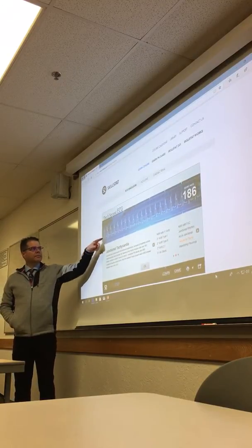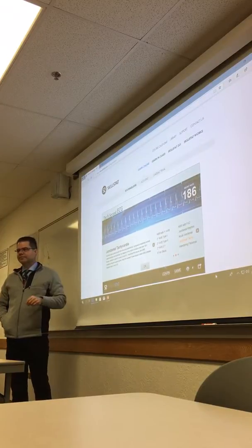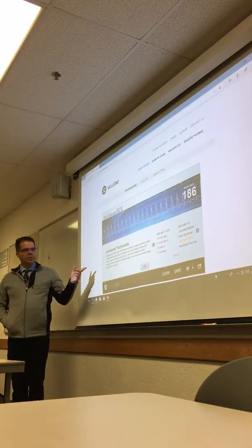Those are not P waves, it's too close to the QRS. I'm just questioning what's the difference between the two? Between the two? Yeah. Okay, so go back to supraventricular tachycardia.